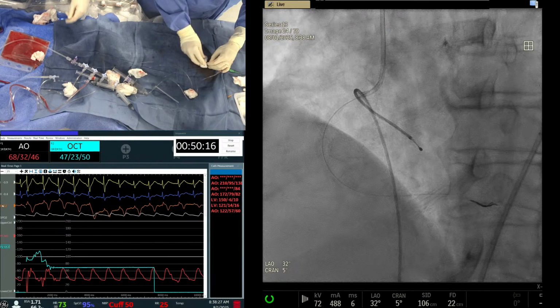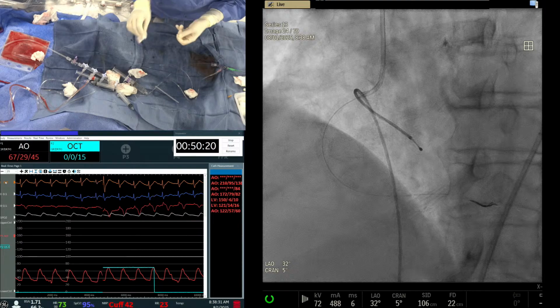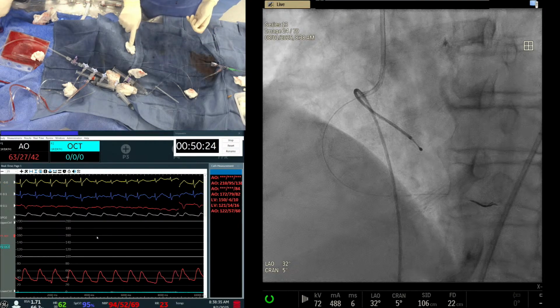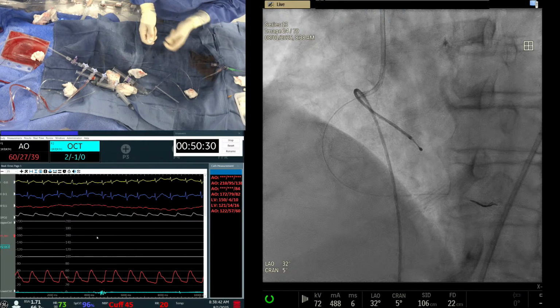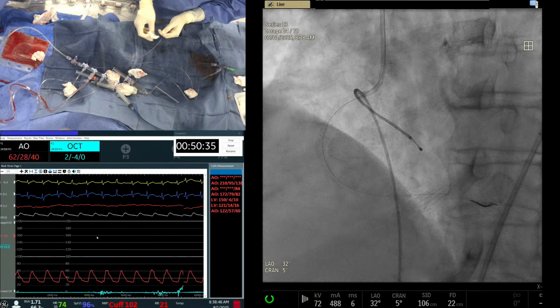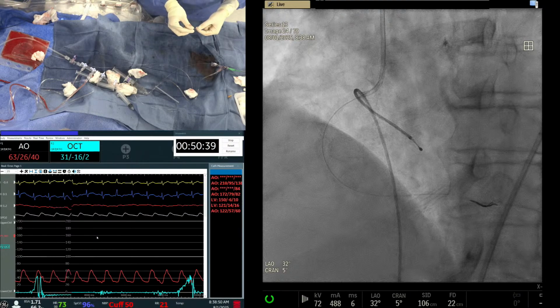Yep. I think what I would do is, we'll do OCT. Normally, the way I like to do is at least three runs. One is pre, one is after rota. That is the time we decide, do you need any adjunct atherectomy. In the past, we used to use cutting balloon. Now we have IVL. And the other thing was, do we need to do RV, otherwise.